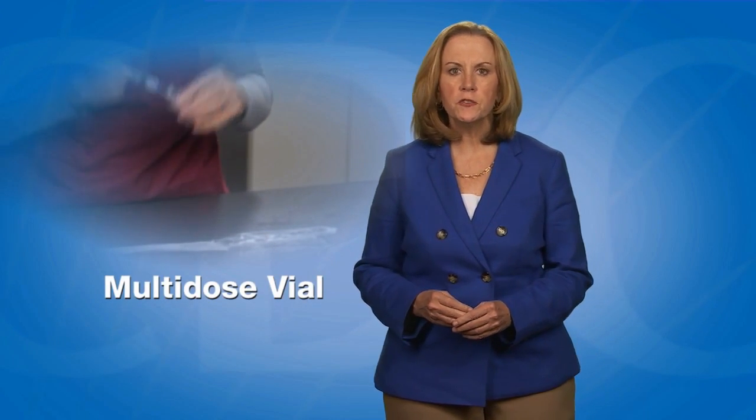In this video, I will demonstrate how to prepare vaccine from a multi-dose vial. A multi-dose vial, or MDV, contains more than one dose of vaccine.